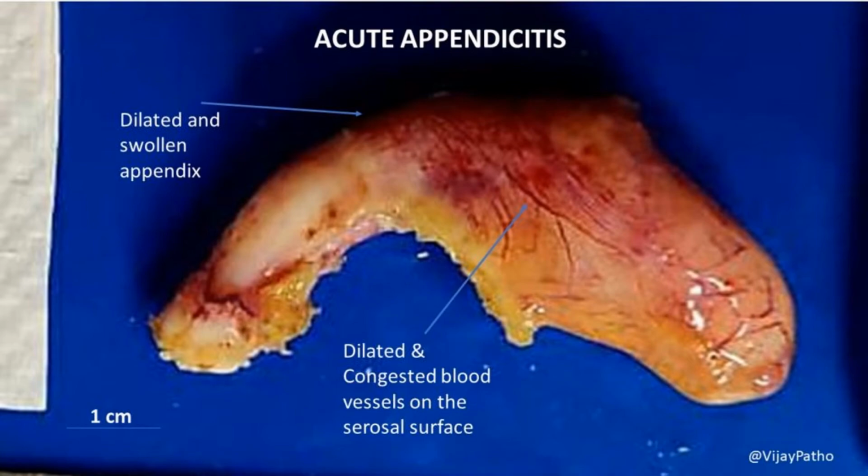This is a practical demonstration for the practical GM number 2 lecture of acute inflammation, chronic inflammation and healing. So the first picture that you need to look into is acute appendicitis, an example of acute inflammation. So this is an appendix.